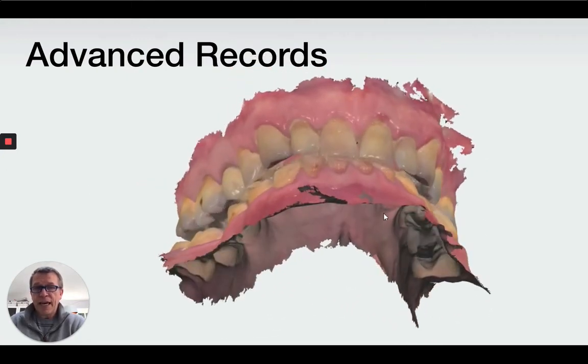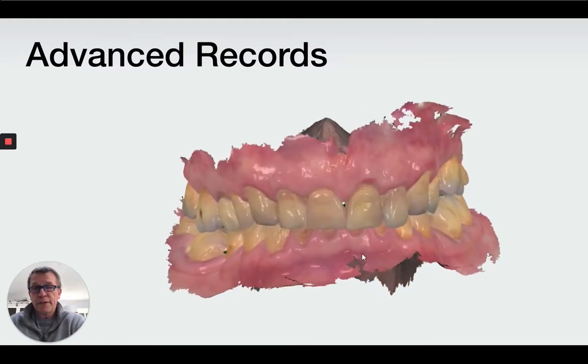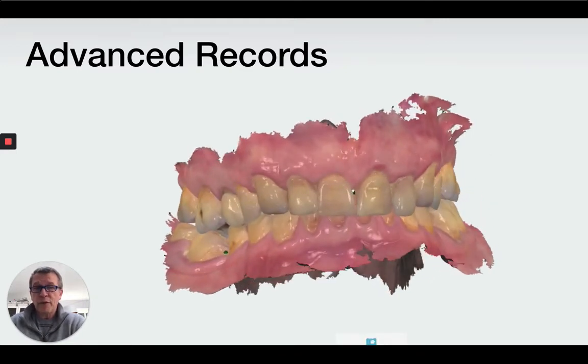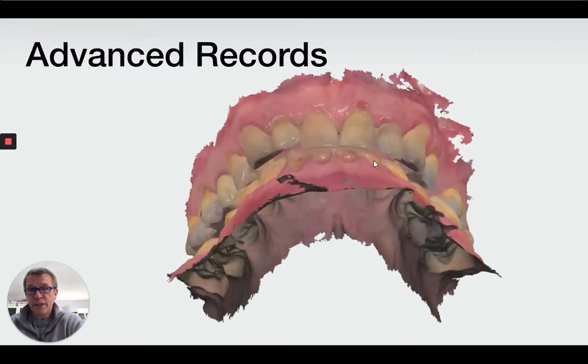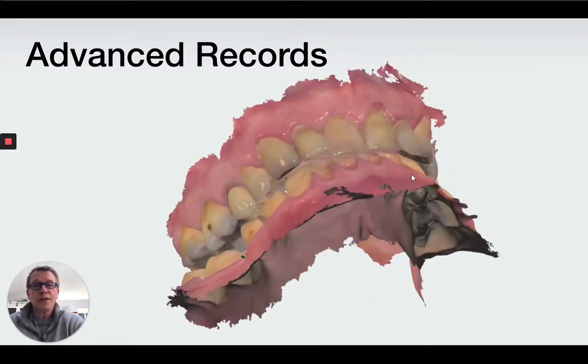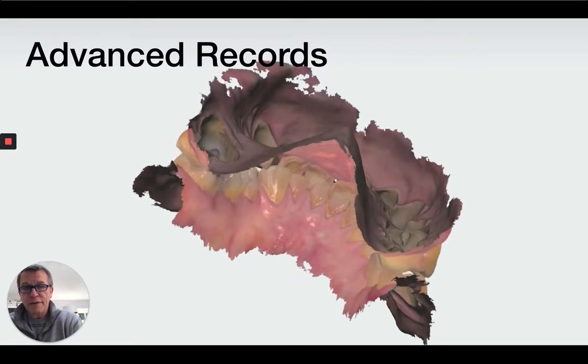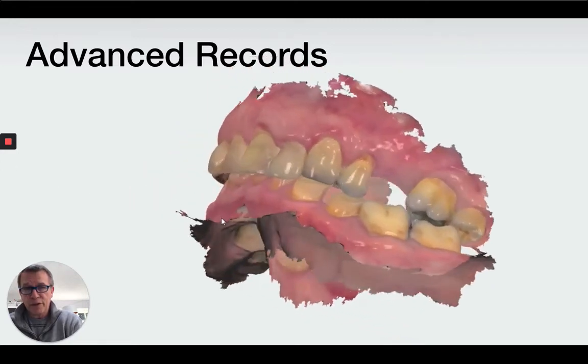So again, that's a whole story in itself. But with someone who's a little bit class 2, you definitely don't want to be opening the bite too much, because the lower teeth will really get away from the front teeth, and then we won't really be able to get much in the way of guidance. So there's a lot of side streets to go down with these sort of cases.